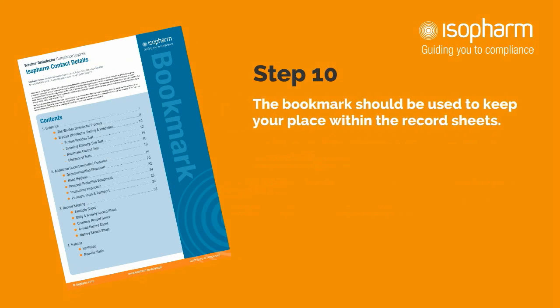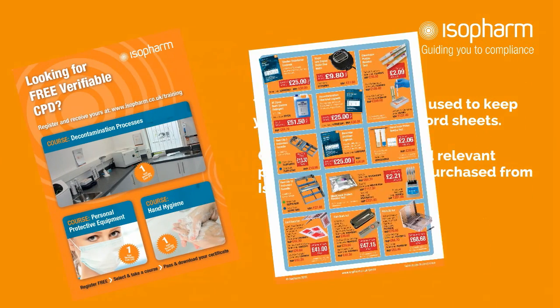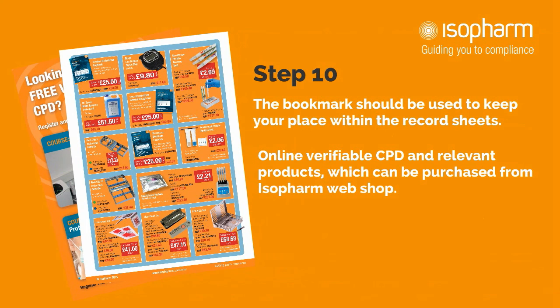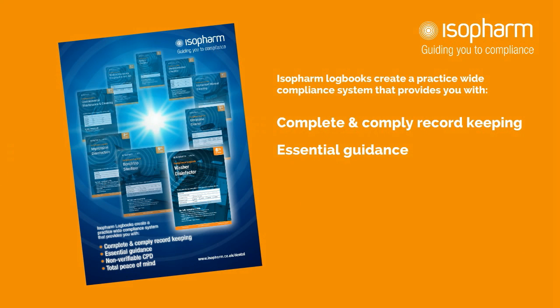Step 10: A unique feature of the Isopharm logbook is the bookmark. This should be used to keep your place within the record sheets. The reverse of the bookmark features details of our online verifiable CPD and relevant products which can be purchased from the Isopharm webshop. Isopharm logbooks create a practice-wide compliance system that provides you with complete and compliant record keeping, essential guidance, non-verifiable CPD, and total peace of mind.